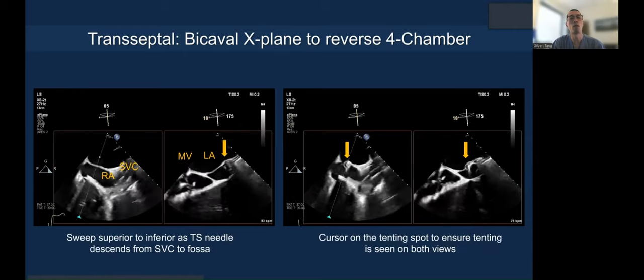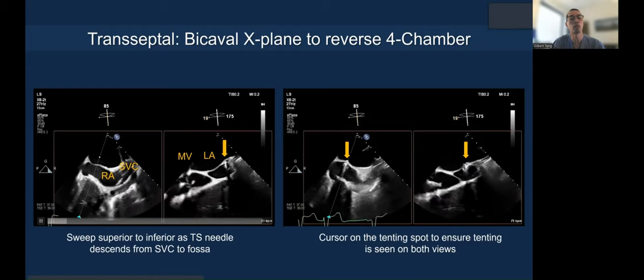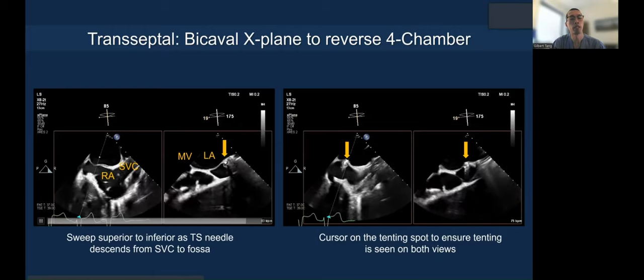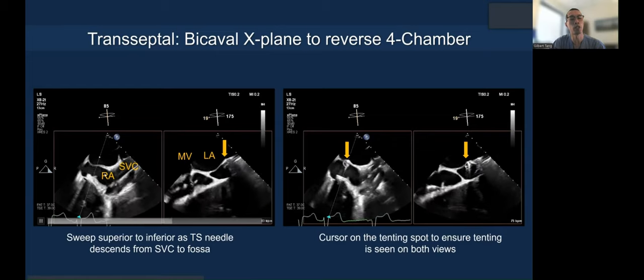Transeptal puncture is very important — use the bicaval X-plane to the reverse four-chamber view. You can see the tenting in this scenario, along with the SVC–right atrial junction and the fossa.